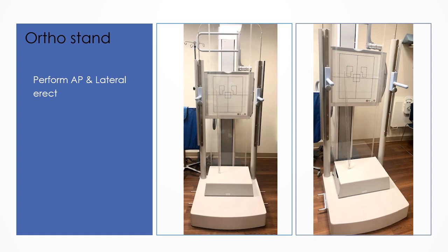This is an example of an ortho stand. You can have the patient stand up there. They have bars on the sides to be able to hold on. You perform your AP and lateral erect. And you can also see, in the background, leaning on the tower, the Bell-Thompson ruler.